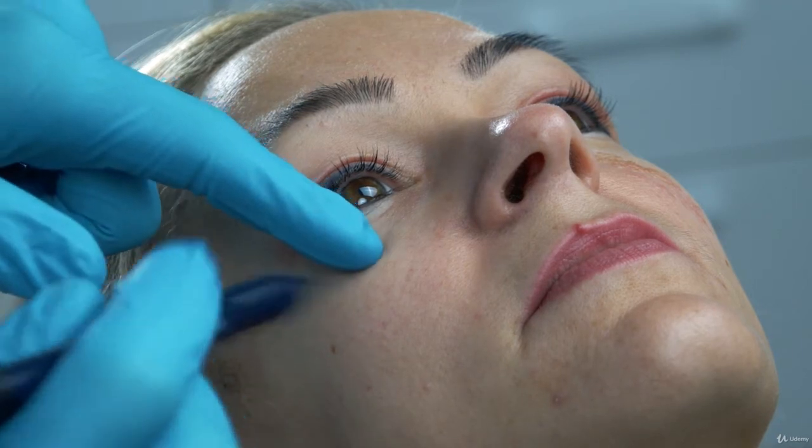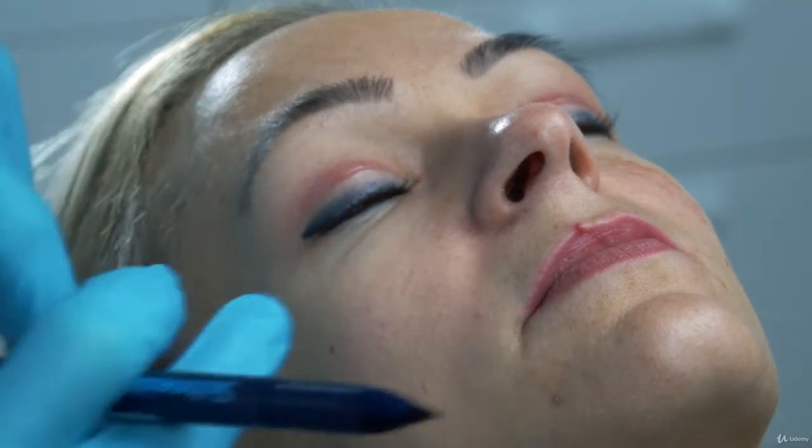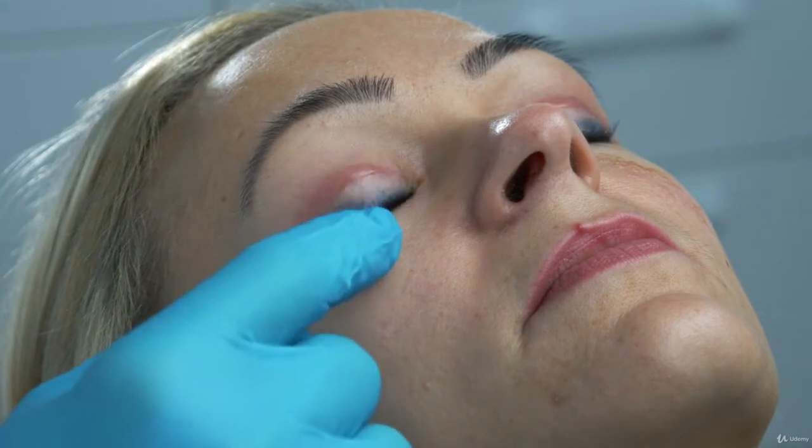So in this video clip, I will demonstrate how a cheek should be marked before injection. You definitely don't need to do so many markings before every injection, but this is an educational video, so we need to be exactly sure where we place the filler, because as you already know, layers are very important, especially in the cheek. So now we have a beautiful young lady who came to our clinic to volumize the cheek.